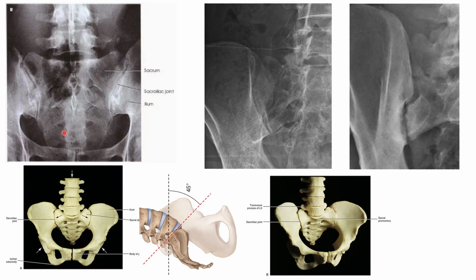But that's okay because this is not a sacrum image. This is a way that you can identify how much angulation is on the tube, by watching what's happening at the pelvic brim here. So we can see the pelvic brim being closed up and foreshortened, and that helps us to identify that cephalad central ray angle. Another thing we can go to is that L5-S1 joint space is open as well. So we'll be able to identify the amount of angulation by that L5-S1 joint space being open, no superimposition of L5 on the base of the sacrum, and then that pelvic brim being foreshortened and projected, the pubis being projected superiorly. So this is what we're looking for, those full open SI joints clearly demonstrated in our AP axial SI joints.